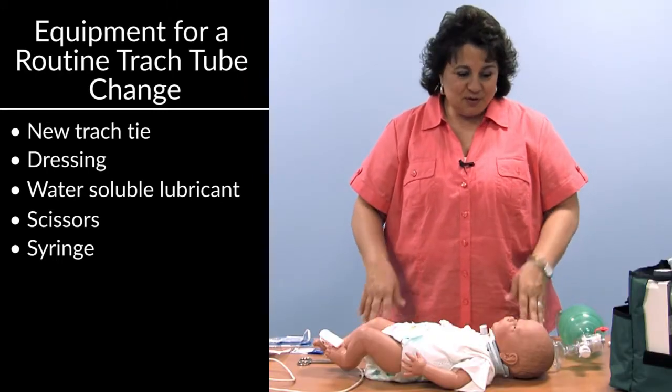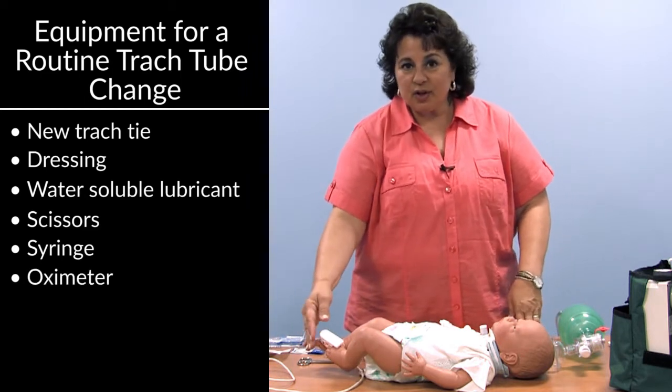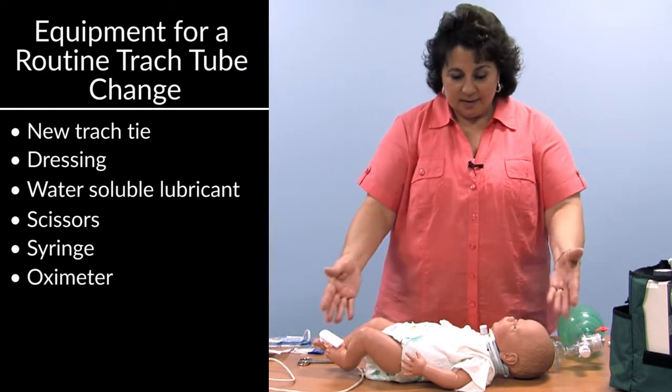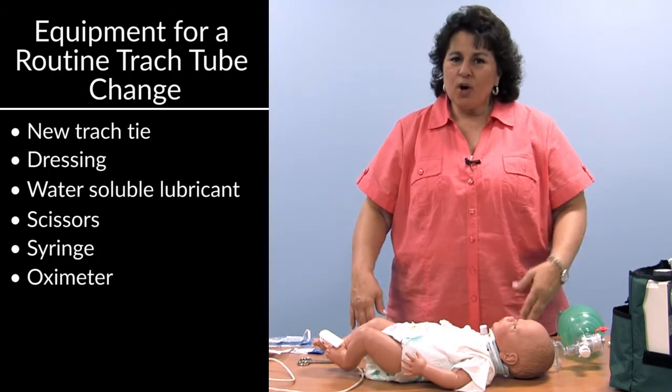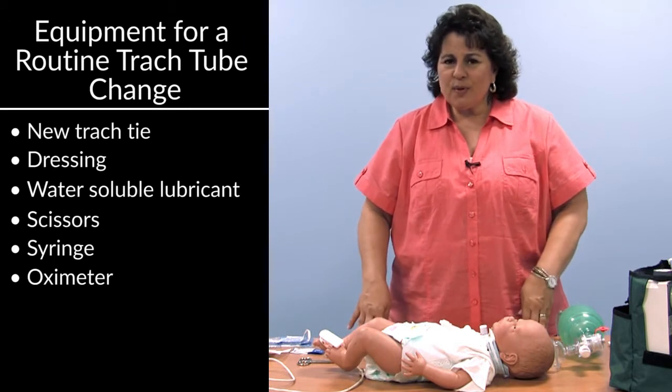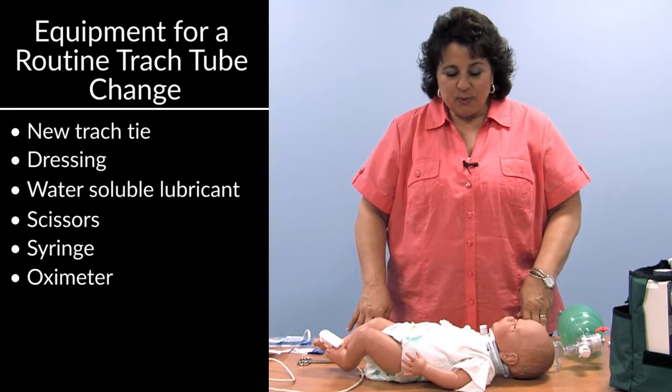Continuing to prepare for this tracheostomy change, it's important to have an oxygen monitor called an oximeter on the child so you can monitor heart rate and oxygen saturation. Although when they're very active and crying, it doesn't always work out so well initially, but it's good to have a monitor to help you assess.